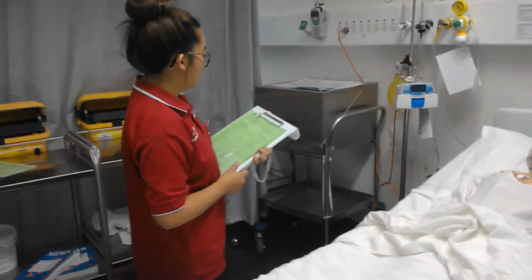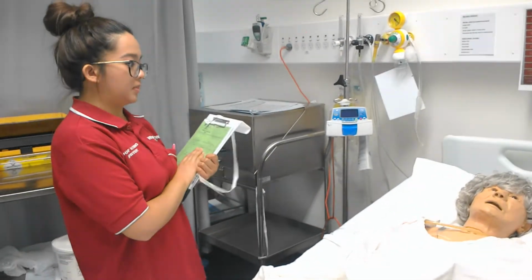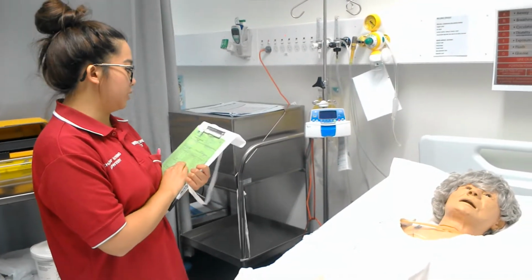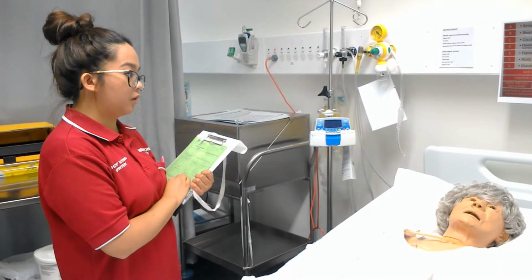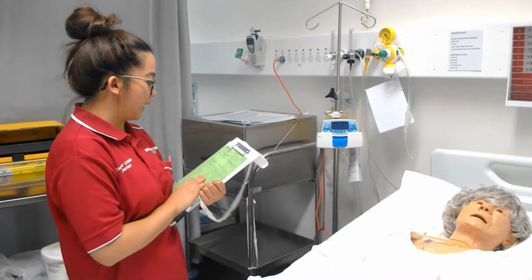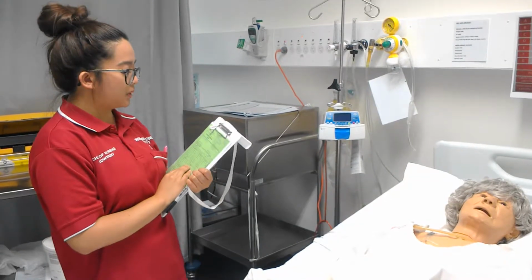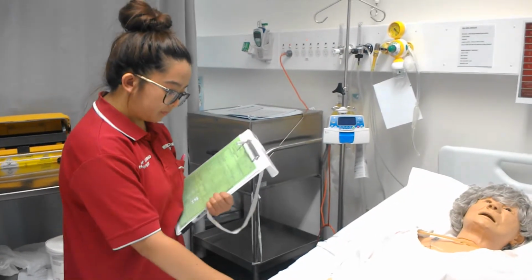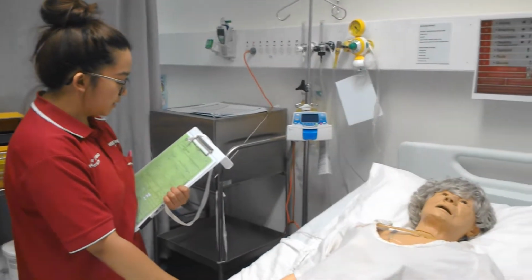Okay, good morning Miriam. I'm Ori, your nurse for today. I can see from your notes here that you're experiencing some pain from your fractured ribs. So what I'll do is I'll prepare some PCA morphine for you to hopefully help you control that pain. But before I do that, I just need to double check your identity. Can you please state me your full name? Miriam Adib.